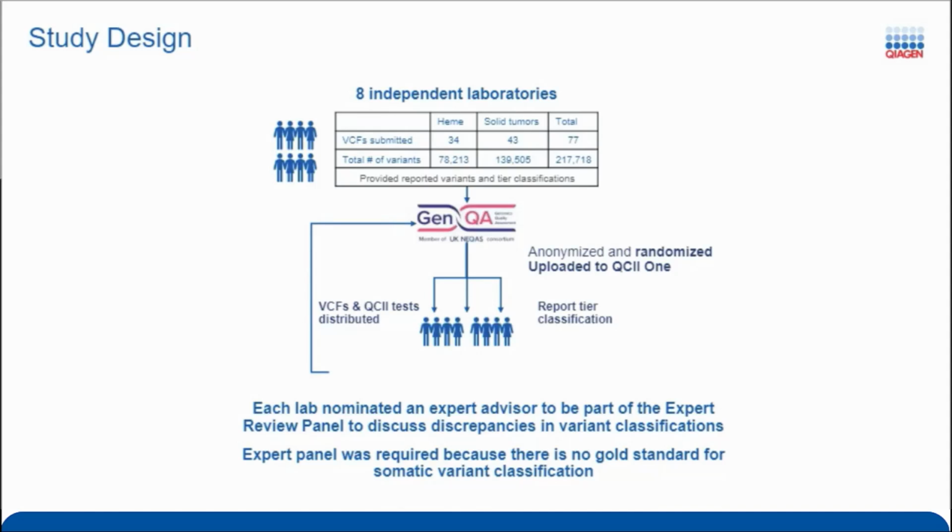One of the challenges from a technical standpoint in variant calling is that as tumors get more heterogeneous, which is definitely the case in solid tumors, the variant calling becomes more complex, right? The software that calls the variant has to make statistical judgments about whether that variant is really enriched. And that, in turn, impacts the way you interpret things, because if you have a variant that the software says is present at 4.9% of the reads, is that biologically significant?